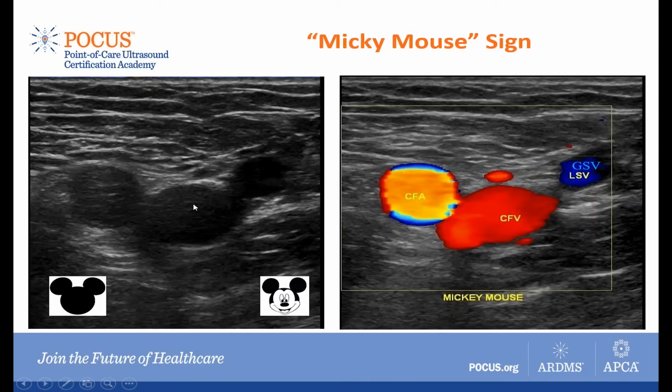Here we have the common femoral vein, and we have the color Doppler view. You can see there's a little valve present over here. And this greater saphenous, or the long saphenous, is actually a superficial vein. But we do want to analyze this area simply because if there's a clot present over there, as you know, blood clots will grow in size, and so they will cross over. And I see lots of patients with these clots extending and traveling in this area and becoming a deep vein thrombosis. And that's also the reason why we like to treat patients within these 2 centimeters of this junction. If there's a clot present here, we want to definitely treat it like a DVT with anticoagulation.